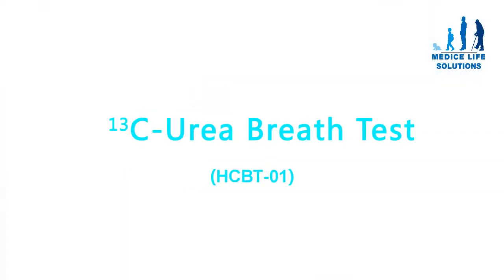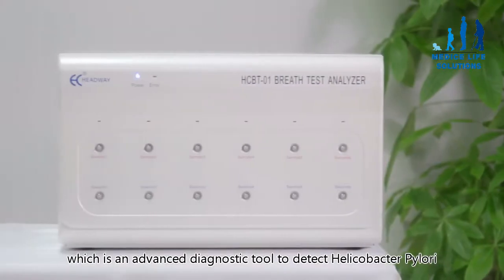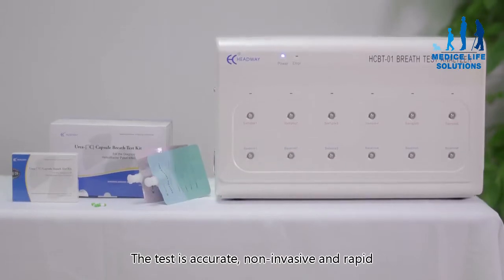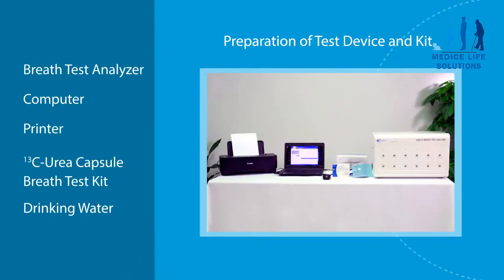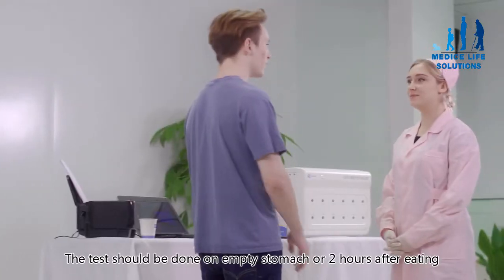Carbon-13 urea breath test HCBT01. Welcome to Headway's urea breath test system, which is an advanced diagnostic tool to detect Helicobacter pylori. The test is accurate, non-invasive, and rapid. Components include: breath test analyzer, computer, printer, carbon-13 urea capsule, breath test kit, drinking water, and sample collection bags.